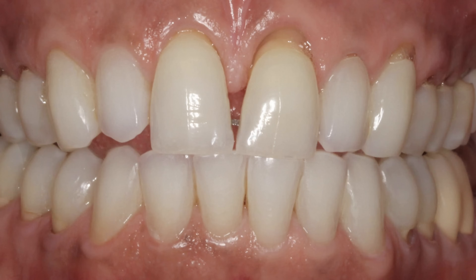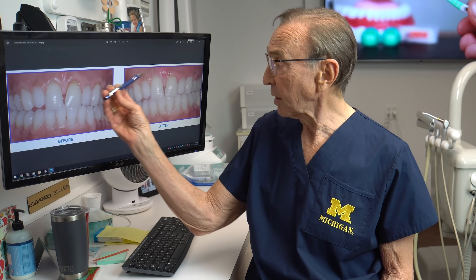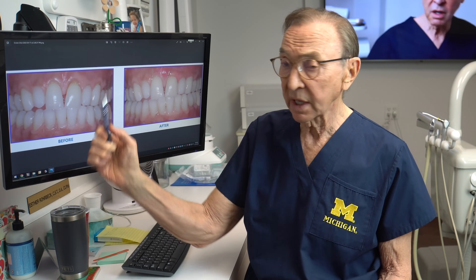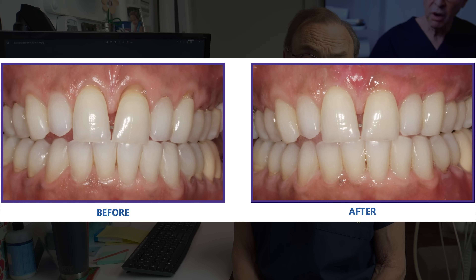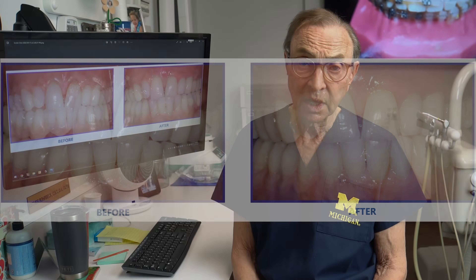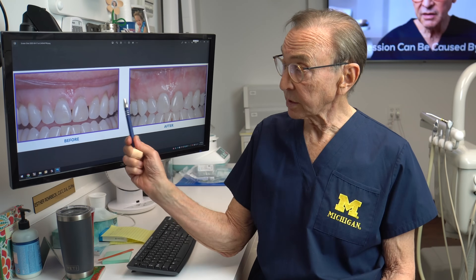Another interesting case — the patient came in very unhappy. The teeth were very sensitive to touch and to cold and wanted something done about it. We did the pinhole technique, covered those exposed roots so that not only it looked better, but there was less sensitivity and the patient felt much better about their smile also.